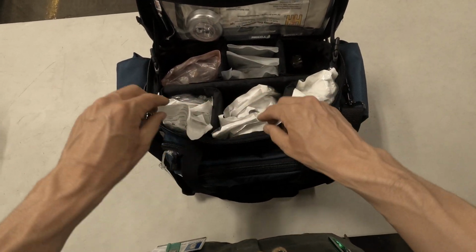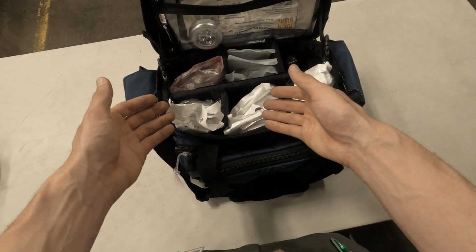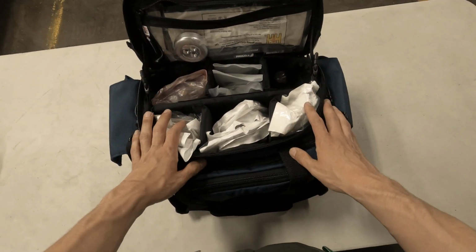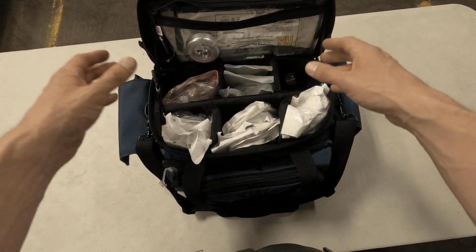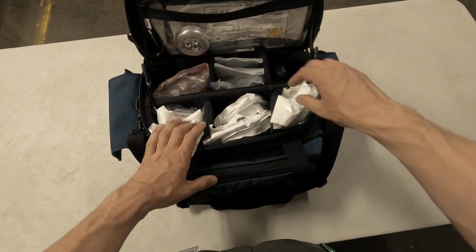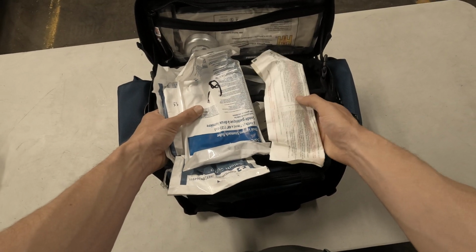This takes the place of just the Ziploc bag that we used to use for spare pumps that was just kind of sitting in the cabinet. This organizes it a little bit, makes it a little bit easier to keep everything contained so it's not just sitting around. These things come from the last bag that we used to use.